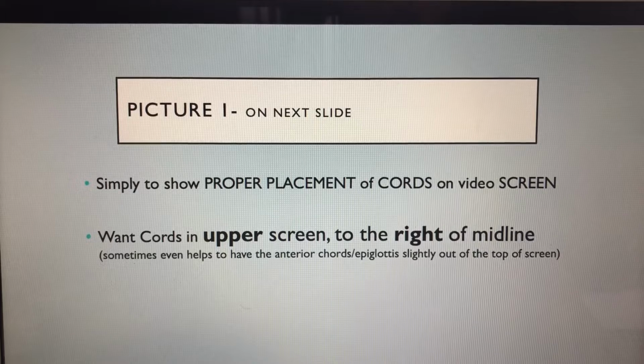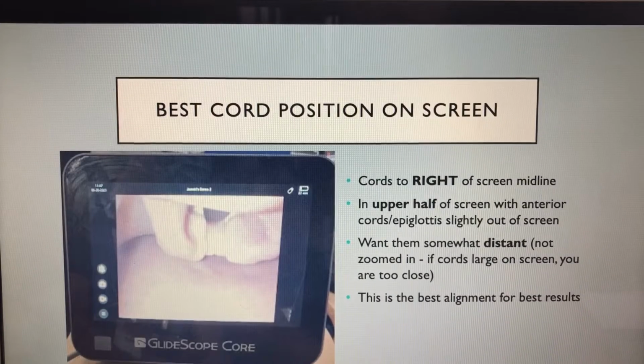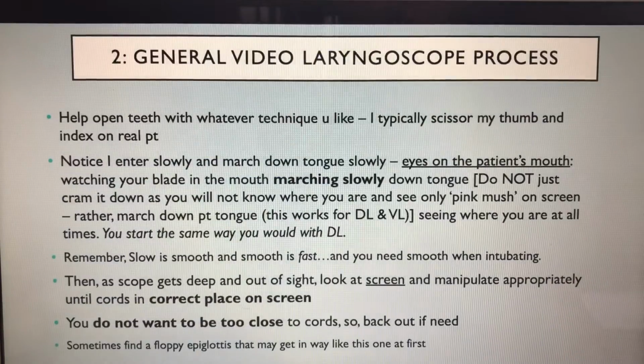On this first picture, the most important thing here is the proper placement of the cords on your Glidescope screen. So you want the cords to be a little bit to the upper right of midline. And let me show you what I mean here. If you look, these cords are positioned to the upper part of the screen. They are to the right of midline, and you want the anterior cords and epiglottis slightly out of the screen. And you want them to be somewhat distant. If you're too close, you're going to see how much trouble you have getting the tube in.